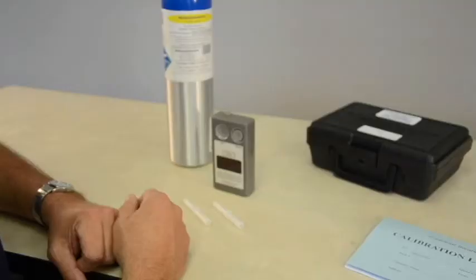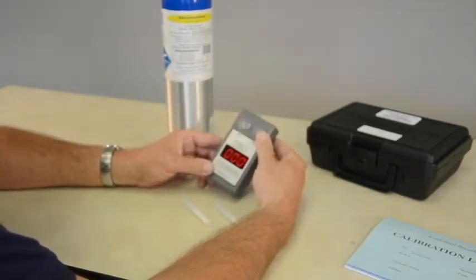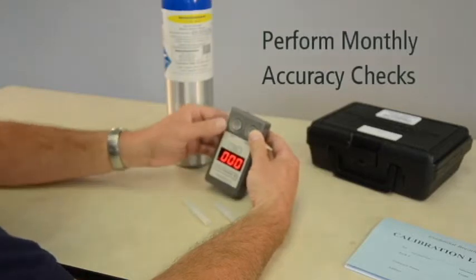An accuracy check is a test of your instrument's ability to read a known alcohol standard within a given tolerance. A best practice is to perform accuracy checks once a month to document that your instrument is continuing to give accurate results.